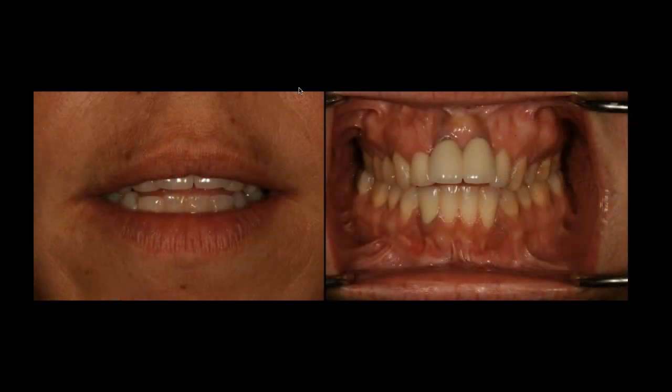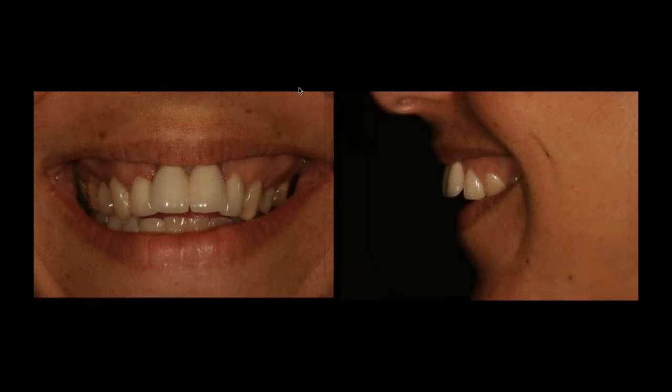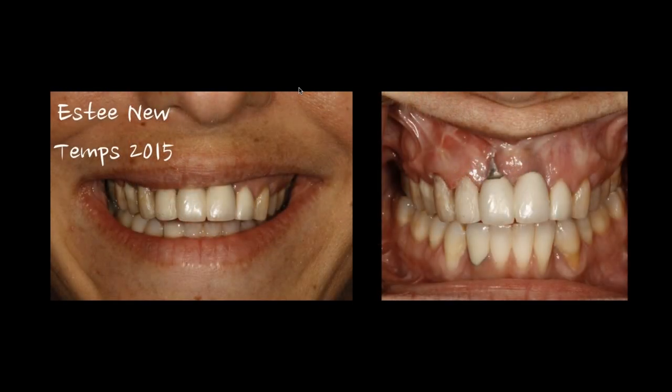But what we did at this point was we looked at evaluating where the teeth belong in her face, right? Rule number one, where should we have that incisal edge position? And I did a diagnostic wax up to get an idea of what I think the teeth could look like. And orthodontically, could we have widened the arch? No, but that would be really more of an ideal situation if we could at that point, but it really wasn't an option for us. So we did a diagnostic wax up and we're going to make her two provisionals to evaluate the process. And I can tell you that these new temps went in her mouth in 2015 over the existing implants.